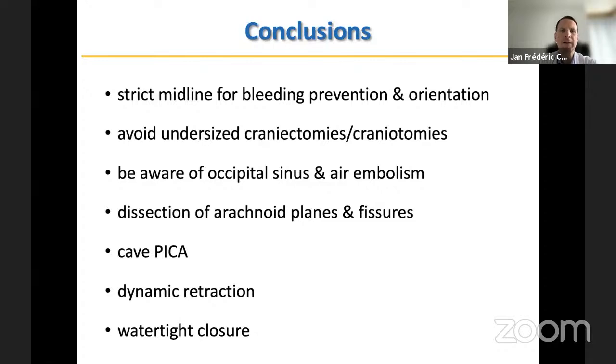Be aware of the occipital sinus and the risks of an air embolism. Then a careful dissection of the arachnoid planes and the fissures, like in Sylvian fissure preparation. Beware of the PICA. Then we prefer a dynamic retraction of the tonsils over static retraction over long periods of time, and then a very nice watertight closure of the approach.